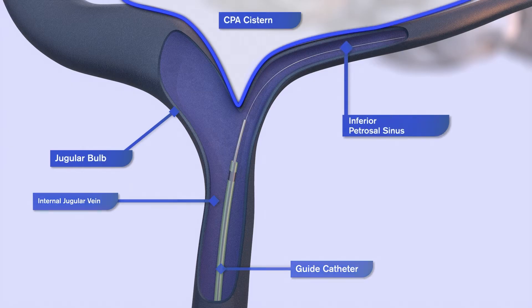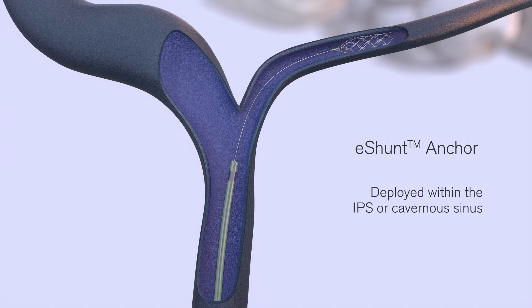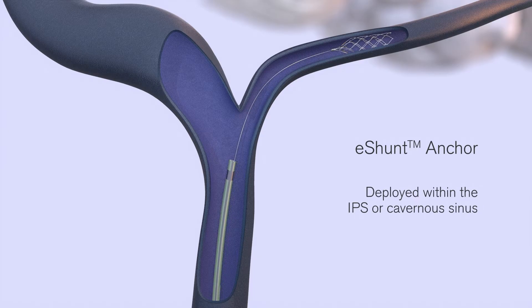Once the micro catheter is in place, the guide wire is exchanged for the eShun anchor. The anchor is advanced through the micro catheter and deployed in the distal IPS or cavernous sinus, distal to the target implantation site. The micro catheter is then removed from the patient, leaving the flat rail extending through the vasculature into the femoral venous access point.